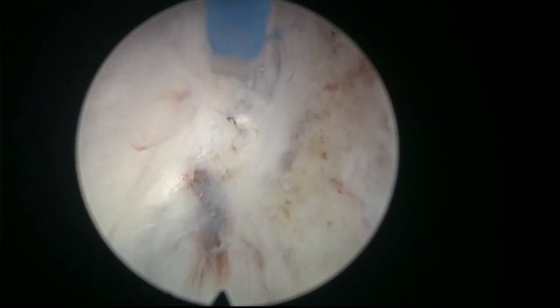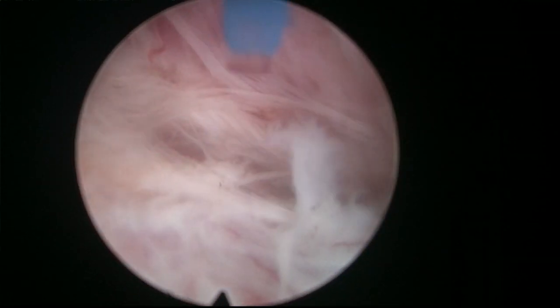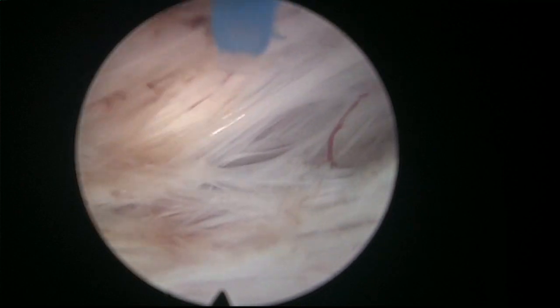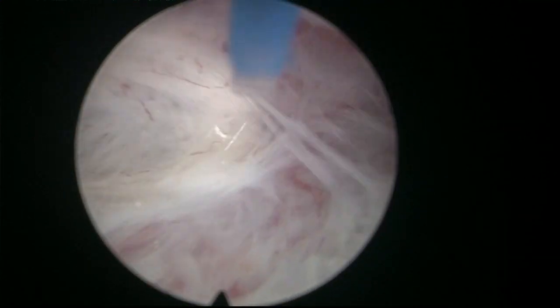But in general, you see, now we have excellent visibility. Very good visibility. That's because we are irrigating a very small space, just the space between the adenoma and the capsule. So that allows us to see very well. And if there's any blood in the irrigation fluid, we'll clear it.